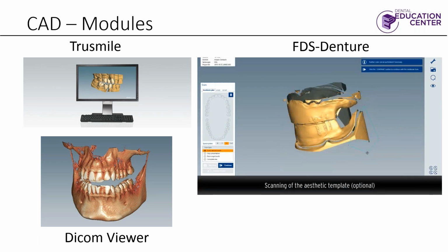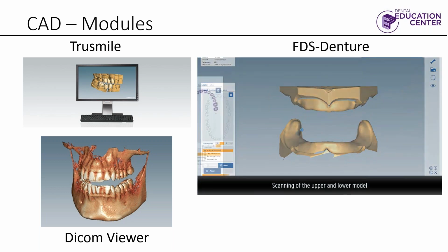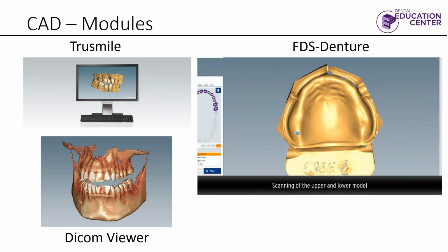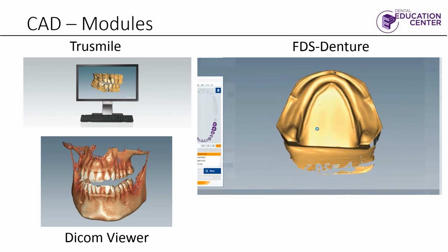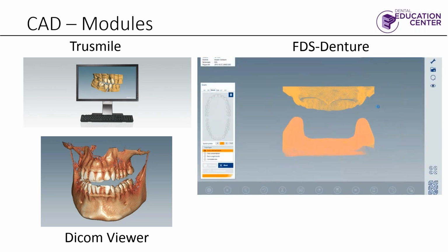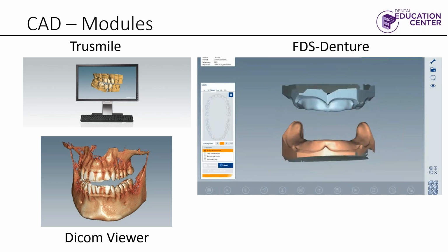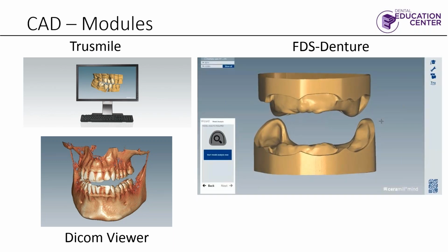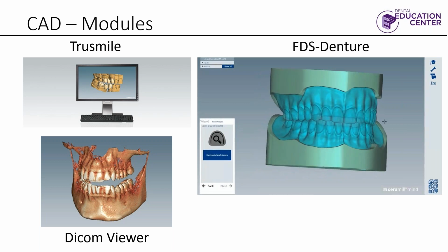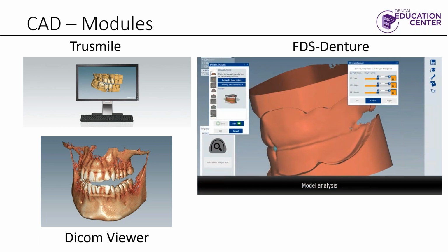So as you can see, all this software starts out with just good acquisition of patient data. That's really important, even before you get into the design of everything. Then you go through and start designing. It gives you a proposal, but you got to tell it a couple of things, obviously.